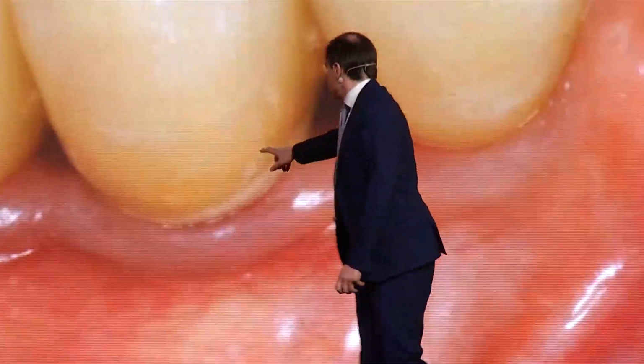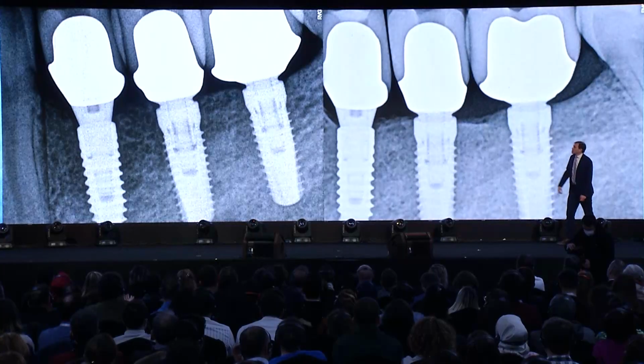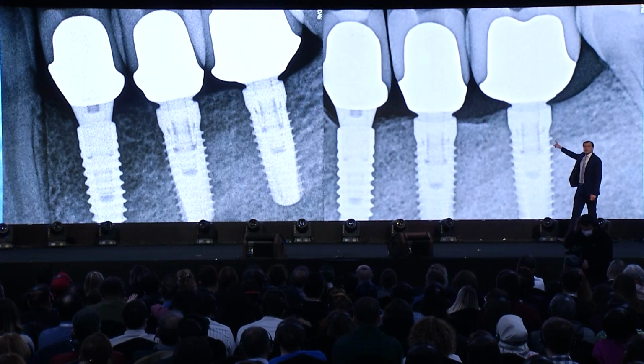And again, I could show a lot of these cases, like delivery, some years follow-up. You see the tissues are thicker. It reflects on the bone stability.